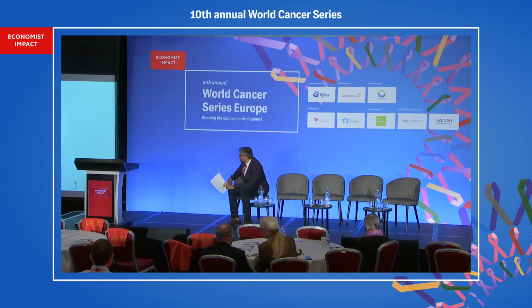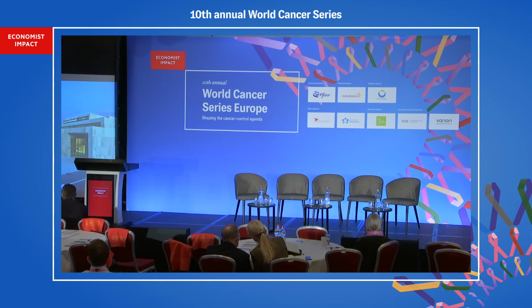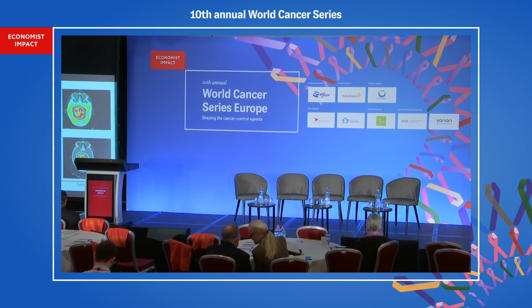Around 50% of the patients treated for cancer receive radiation therapy as part of the treatment. Photon-based treatments are the most widely used technique of radiation therapy. Protons, relative to photons, spare healthy tissue by depositing minimal energy before and after the tumor. The theoretical advantage of proton therapy lies in the ability to minimize the radiation dose to the healthy tissue. Proton therapy may improve survival or morbidity or reduce the risk of secondary cancer related to radiotherapy.